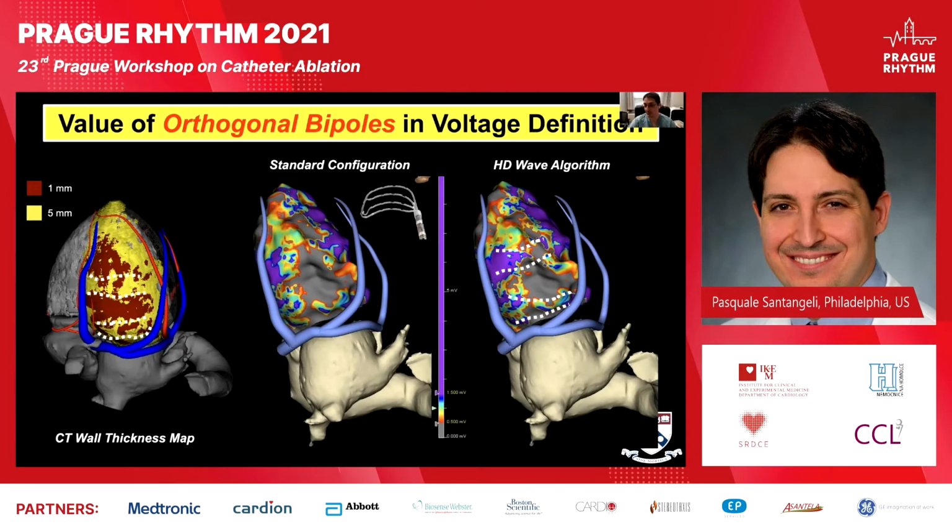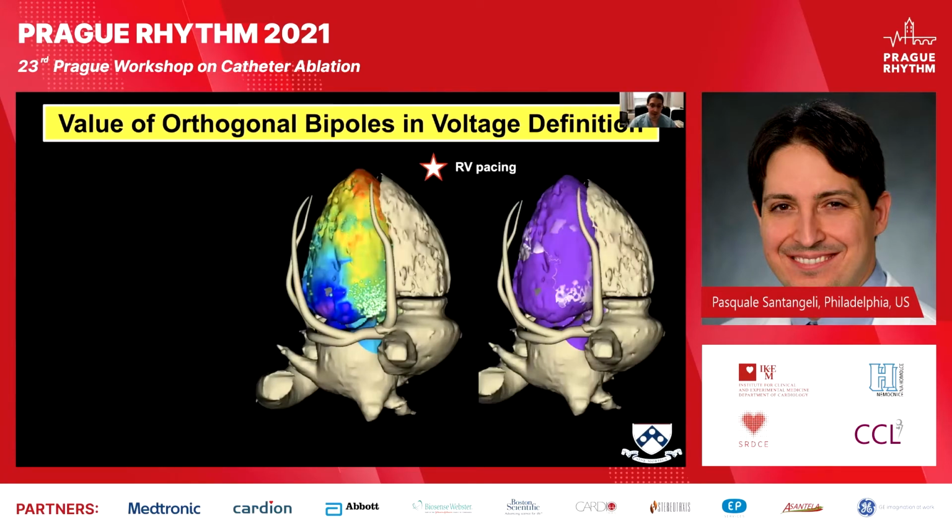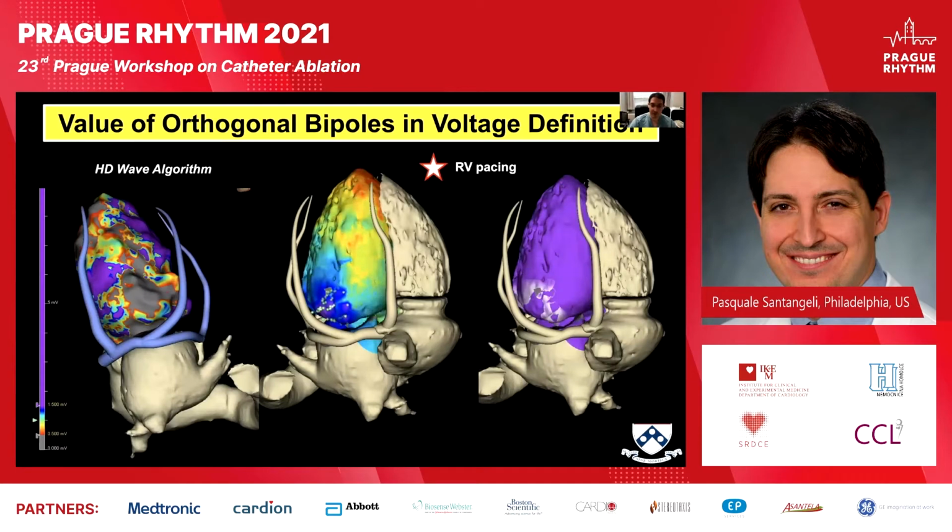So basically, it's relatively independent of the angle of incidence of the catheter compared to the wavefront of activation. These voltage channels can correspond to activation channels that can be visualized by changing the wavefront of activation. In this case, from sinus rhythm to RV apical pacing and quickly performing a remapping, you can appreciate two sites of breakthrough here. And again, we're looking at the apex from here, the RV apex early activation, and then the inferior wall is an inferior view of the left ventricle.